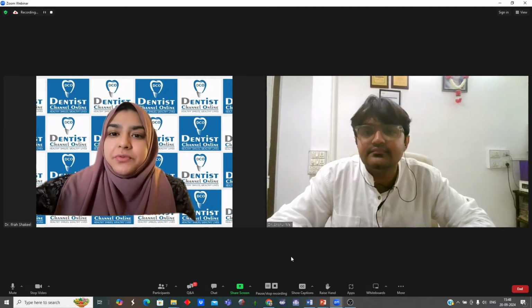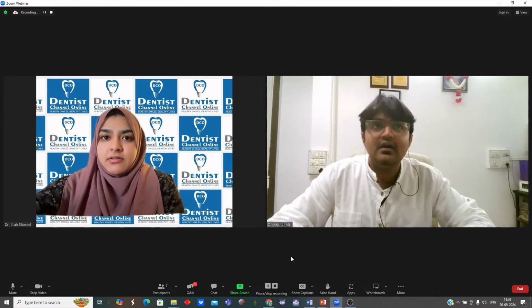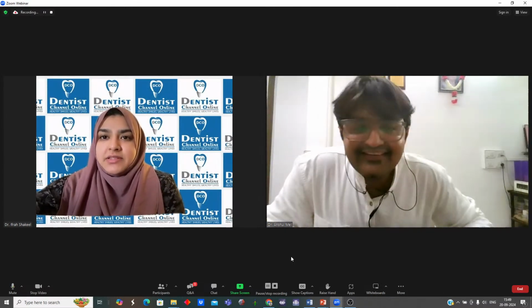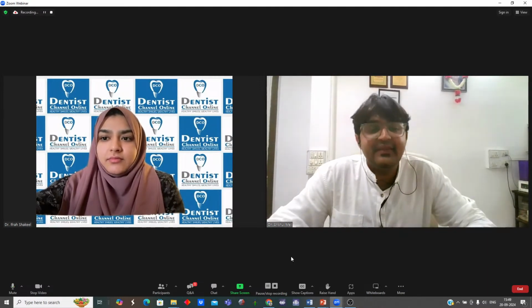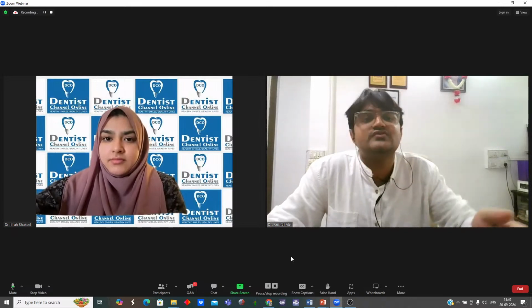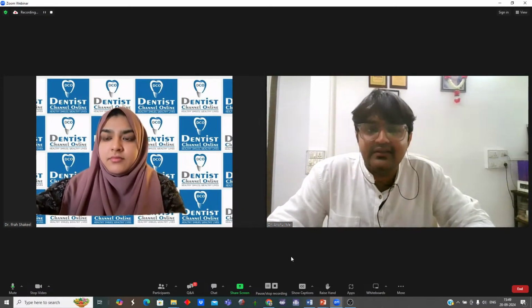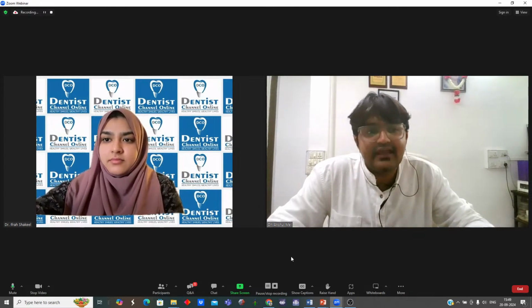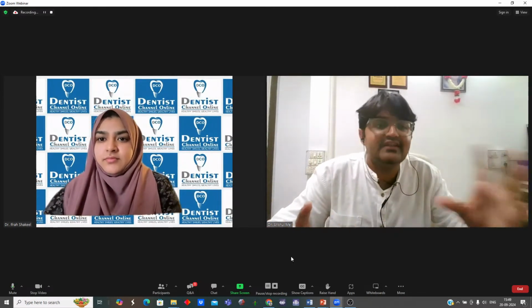Which software is better to design a surgical guide for dental implants? Could you mention an example? Yes, so to be honest, all software is fine, but the main thing is you should be thorough with the knowledge of how to use the software. In my case, I'm using Exoplan because I'm using ExoCAD as well, and maximum labs are using ExoCAD for the prosthetic design.